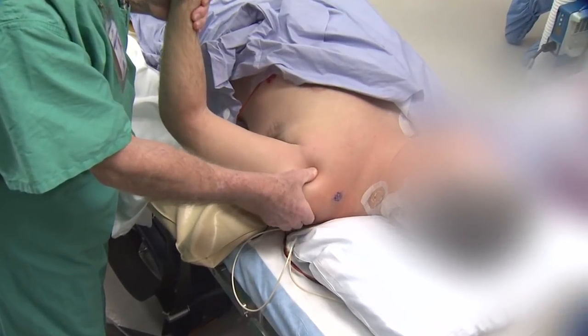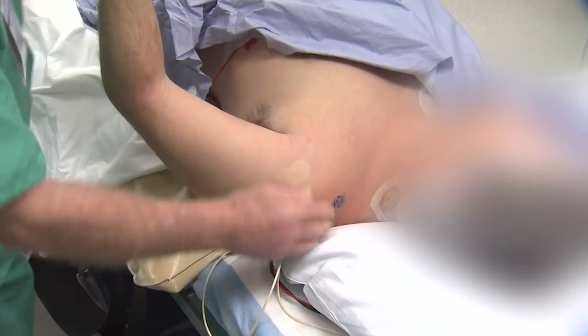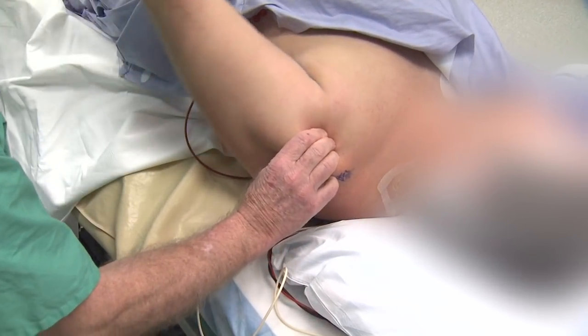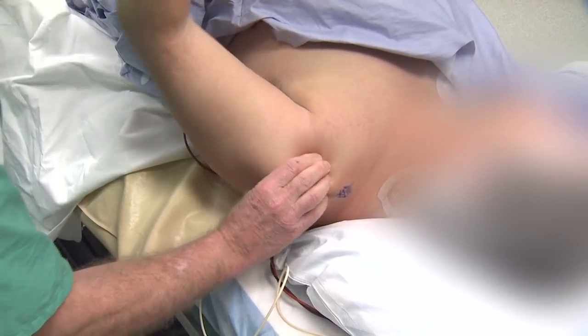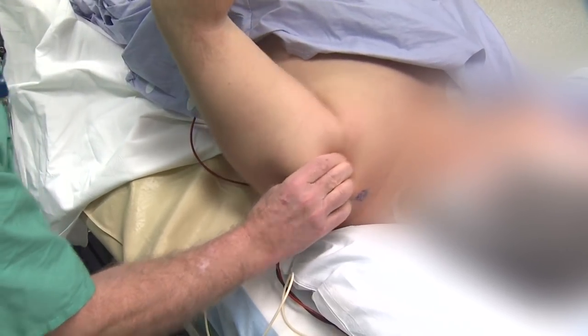The first step to success is to determine the amount of anterior translation and whether in fact this patient dislocates right over the rim — which, as you can see here, he does. We then assess his inferior translation as well.